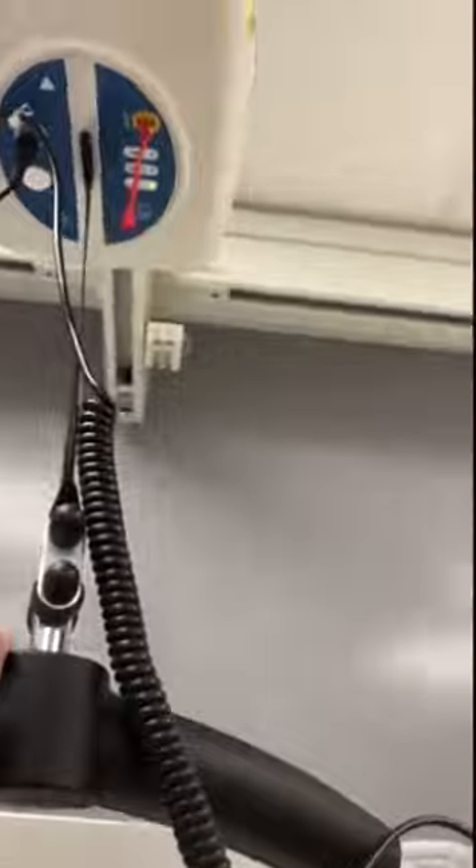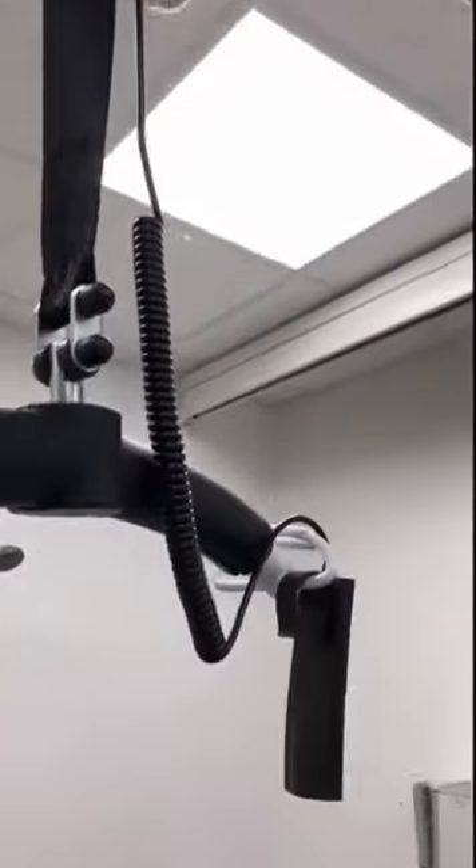The hoist will go across all aspects of the room, so someone can be hoisted from any position and taken to any point within the toilet facility.